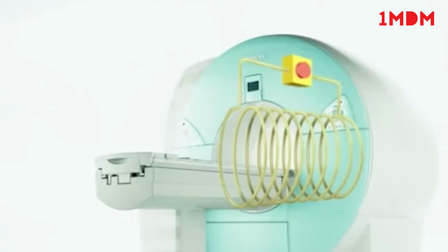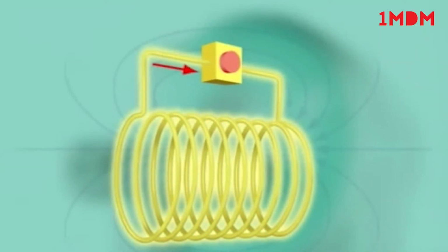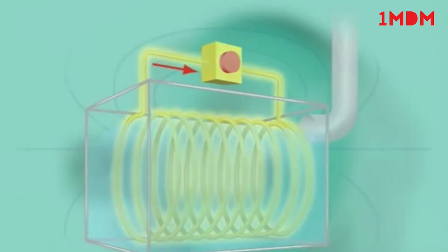Superconducting magnets are the most commonly used magnets in clinical imaging and are used to generate higher magnetic field strengths. Electrical current flows through wire coils and are cooled by liquid helium to 4 Kelvin above absolute zero, which is minus 269 degrees Celsius. The current is provided by a power supply unit during installation, but once superconduction is established, it can flow without an external power supply for several decades. Once cold, the current flows continuously through the circuit and generates the static magnetic field. In case of an emergency, a superconductive electromagnet can be switched off at any time.